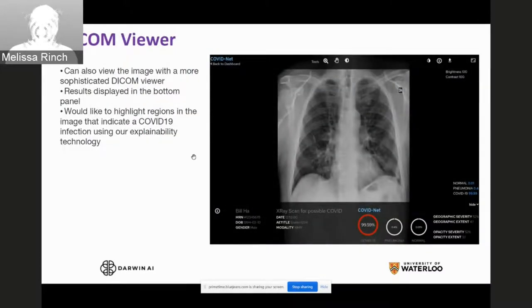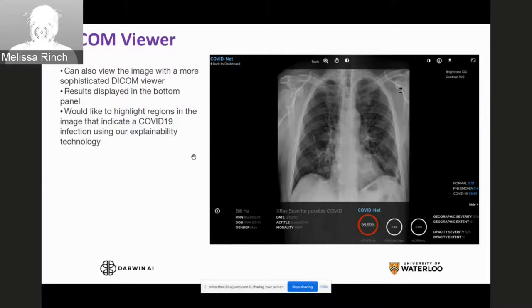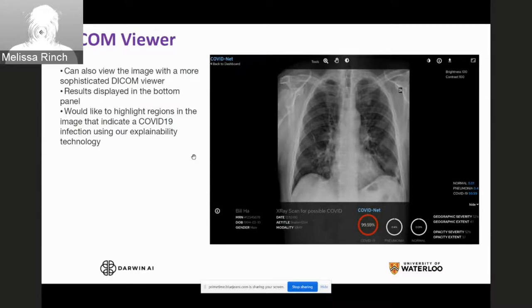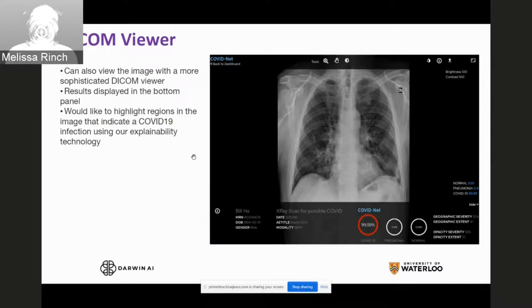If the likelihood of an individual having COVID-19 pneumonia is very high, then the other two models — the geographic severity and the opacity models — give the risk stratification as well as the opacity for that patient. We're also working on a DICOM viewer that allows the radiologist to view the chest X-ray in more detail. Darwin AI has explainable AI technology that allows the user to see the regions on the chest X-ray scan that the model used to make those decisions. Moving forward, we'll enable our explainable AI technology as an API in this COVID-NET application to highlight those regions for the radiologist.